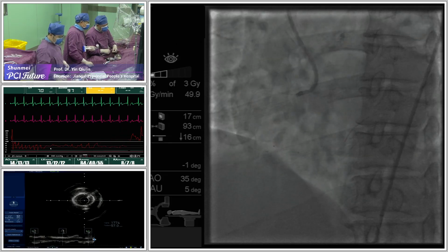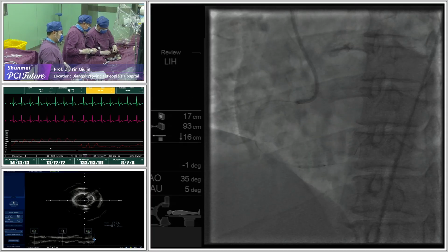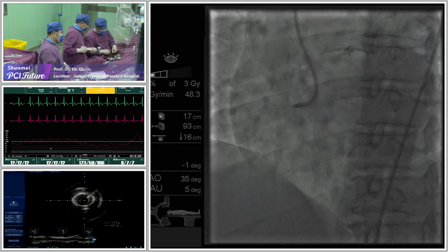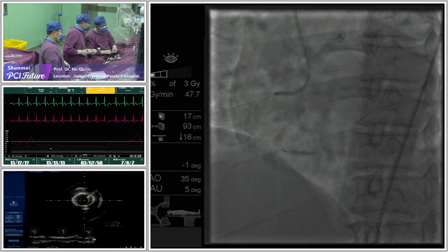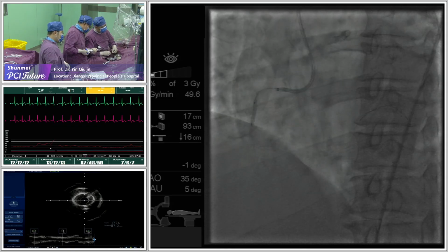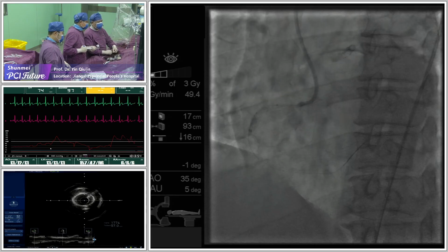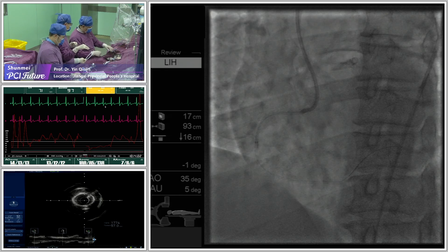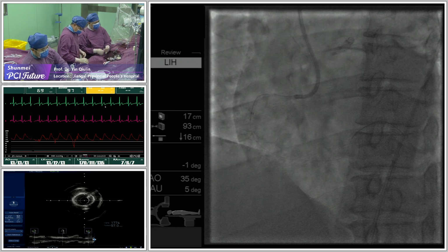您觉得放支架前有没有考虑把这个延长导管尽量送远一点？因为虽然是预处理过，但是可能支架。对，我也是这样想的。后扩球囊塞进去以后，血压这个压力就没了，所以我想塞的时间尽量短一点，我把远端先扩张一下，最后把它塞进去，这个延长导管再插远一点，这样缺血时间会短。来，这里打起。Now we are trying to apply the guide extension catheter to longer distal segment. 我现在延长导管已经插进去了，但是它的压力马上就下来了。来，把支架拿过来。Now the guiding extension catheter has already been applied. Now we are ready to put in the stent.